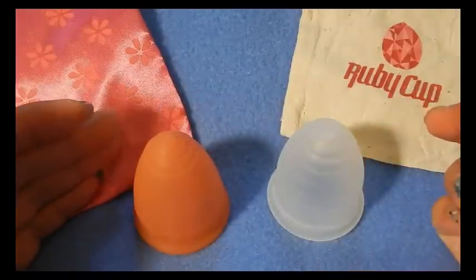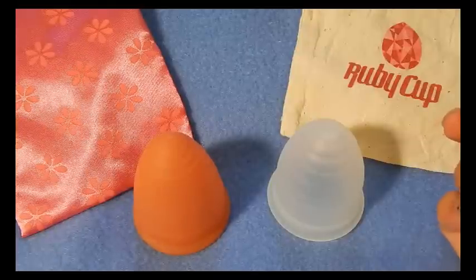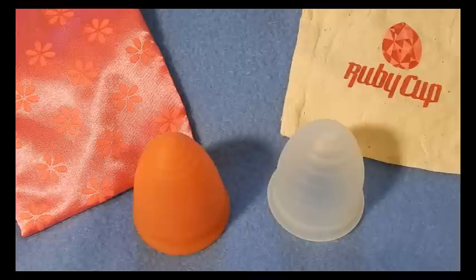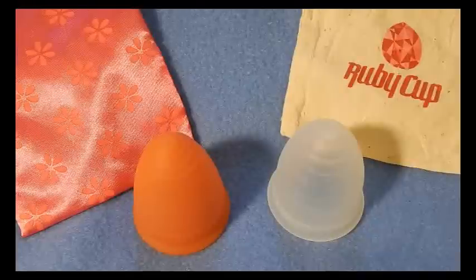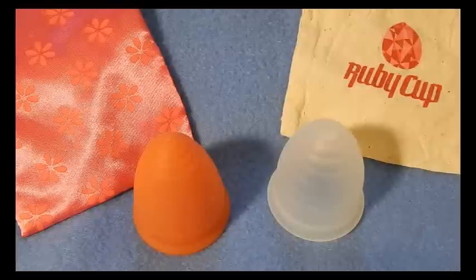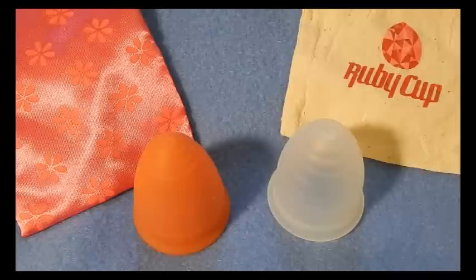As for the price points, the Lunette is $39.99 normally, but you can find a lot of sales and discounts on them. Check out their Facebook page — they do list a lot of sales and giveaways. The Ruby cup has two different prices, approximately $31 or $32, I think it depends on what color you get. Do like both of their pages for discount and giveaway updates.